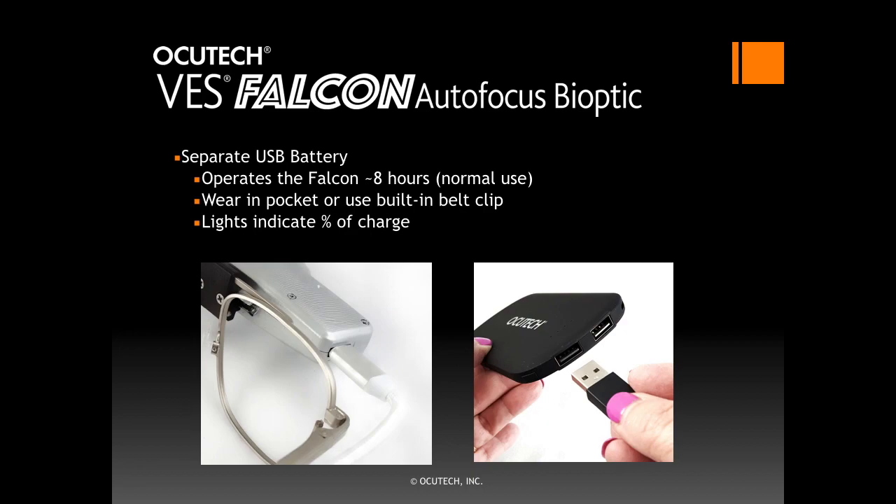Attach the Falcon to its battery with the USB cable provided. We recommend that you only use batteries provided by OccuTech as they have been tested to provide the proper current. The smaller end of the cable will snap into the power port on the side of the telescope; it does not normally need to be removed. Clips on the frame temple are provided to hold the cable in place. Simply insert the large end of the cable into either port on the top of the battery and the Falcon will start immediately. When pressing the button on the side edge of the battery, the number of lights illuminated will indicate the percent of the battery's charge. There is no power switch. To turn the Falcon off, simply remove the cable from the battery. Charge the battery overnight as you would your cell phone.